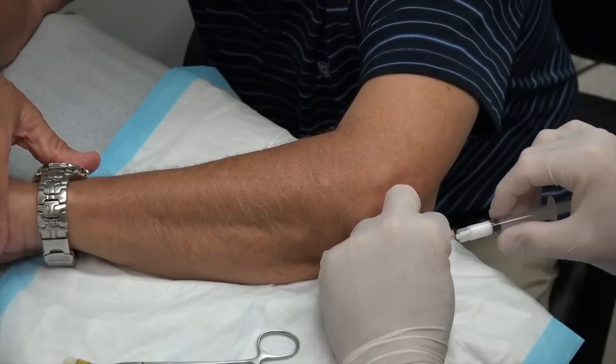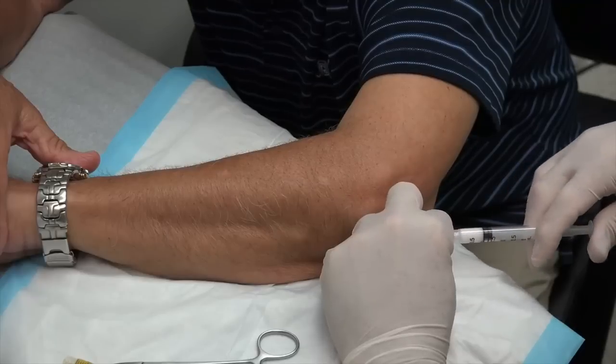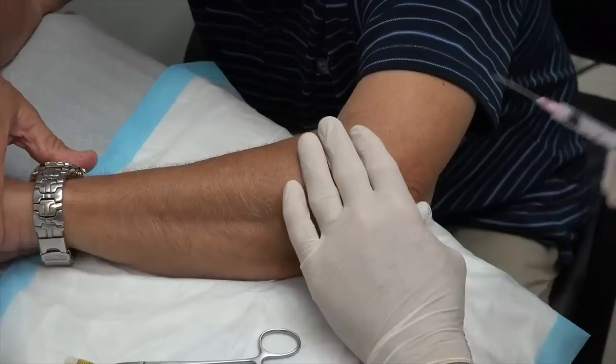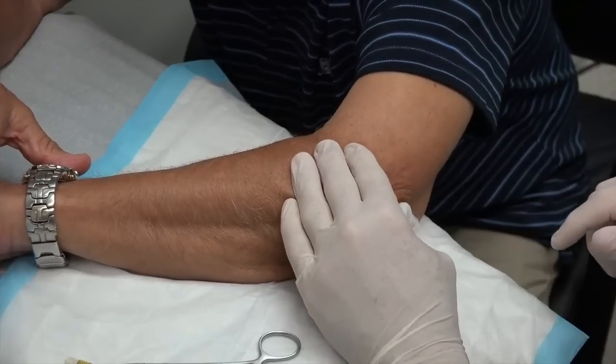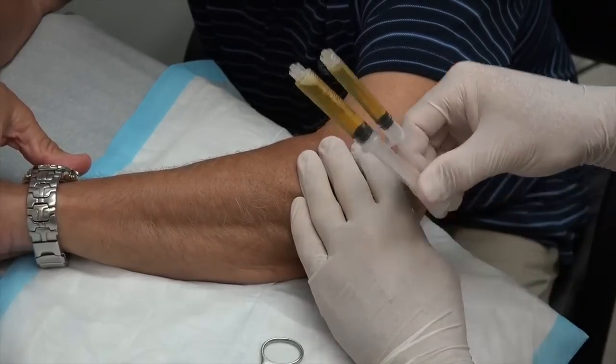We'll go ahead and put a little cortisone in there and put a little wrap on your elbow for you, and hopefully we can prevent this from coming back. You did great, my friend. You got a lot of fluid out of there. Look at all that fluid — that's pretty amazing.